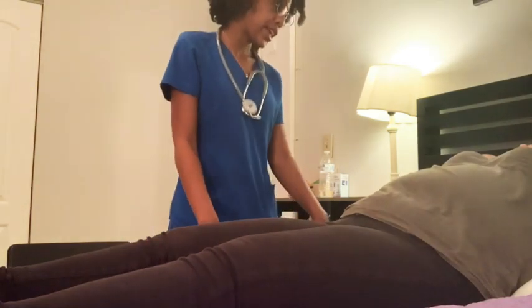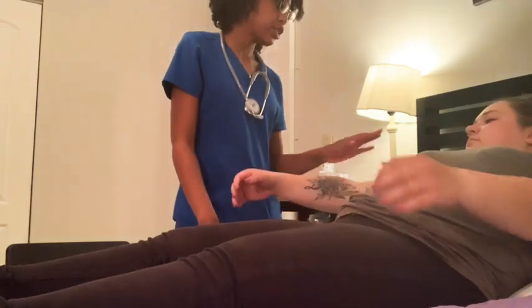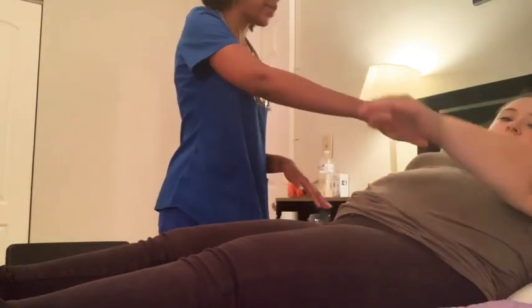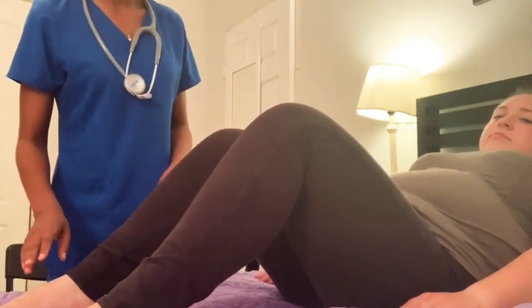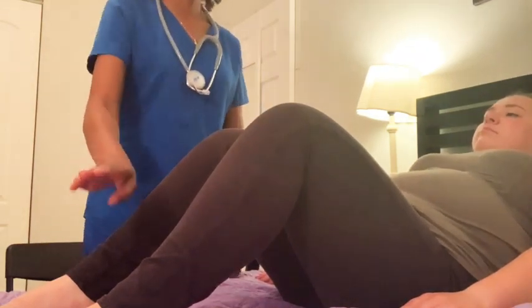Now I'm going to assess your ankle brachial index. With this, I'm going to take 2 systolic blood pressure readings on the right arm and average that. Do the same for the left. That's the denominator. Then I'm going to take my Doppler and I'm going to assess 2 systolic blood pressures on the right. Take the average of that, and that's the numerator for the right. And do the same for the left. That's the numerator for the left.